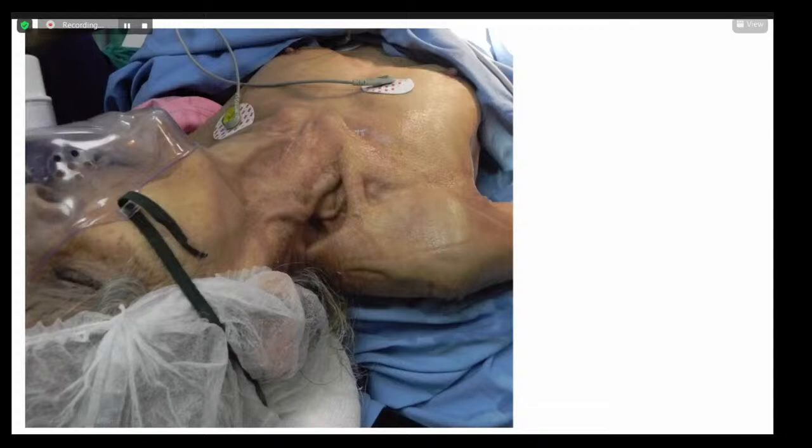So, yeah, please. I'm Dr. Mithra, Sandeep. I have tried this in some of the cases where the arms were not getting abducted. We have put the probe directly into this type of arm only, where it is not abducted, it is straight, and we put the linear probe into that and give a vertical axillary block. It was difficult to visualize the artery initially. But with some manipulation, we could identify the artery and we could give that block.